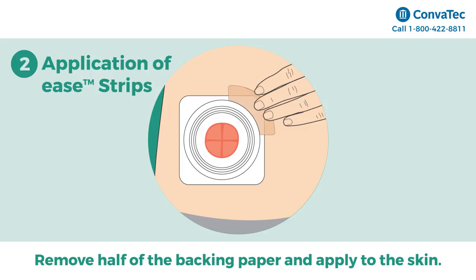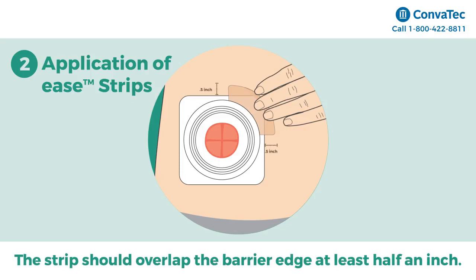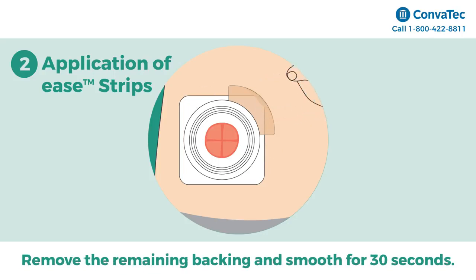overlapping the edge of the barrier. The strip should overlap the edges of the skin barrier at least half an inch. Remove the remaining backing and smooth down for 30 seconds to allow the strip to adhere.